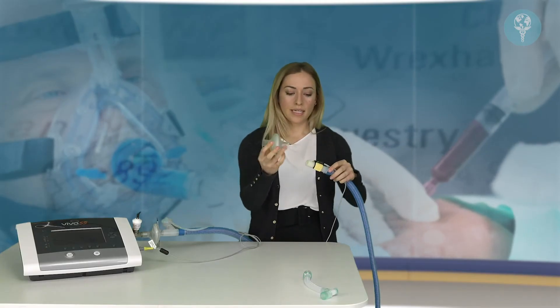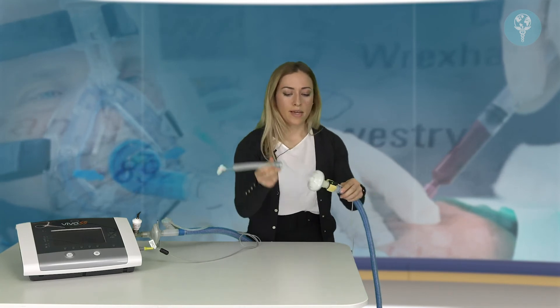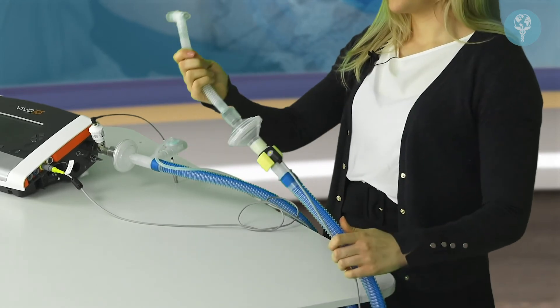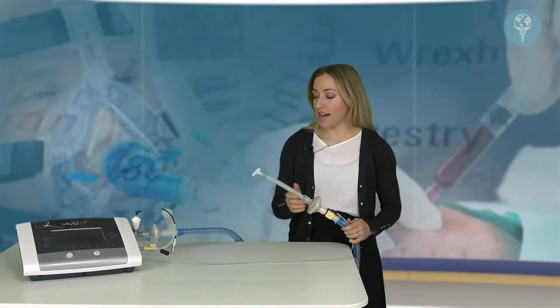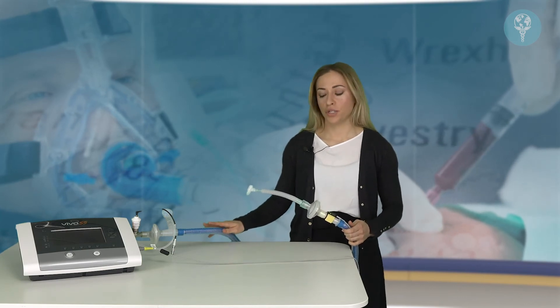We then have our next antibacterial filter which sits on the end of the circuit. And finally we have the catheter mount, which we attach to the endotracheal tube. In this video we've covered how to set up the active exhalation valve circuit for use with an endotracheal tube.